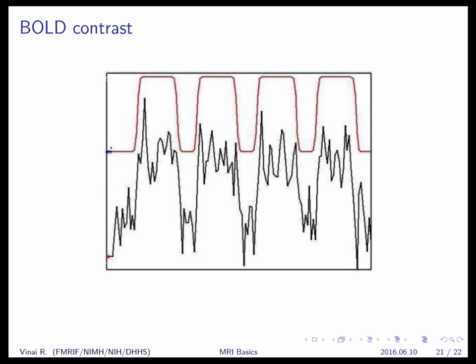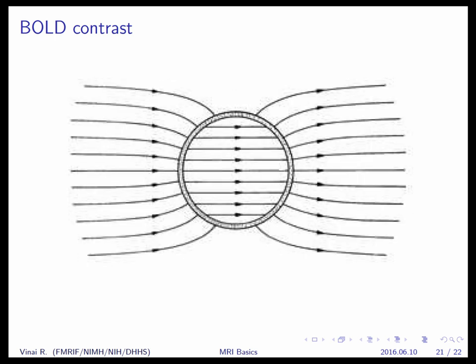Okay. Is that okay? I have a random question. Absolutely. If you go back to the image, go back two slides, that slide. So if the magnetic field is technically higher inside of the veins, if you were only interested in veins, let's say, yes, if you had a very short TE and you did that image, you would get a very good image of the veins. Like a better image of the veins compared to.